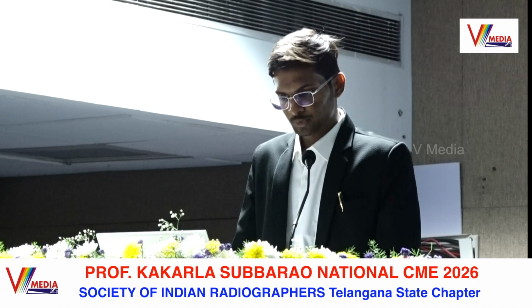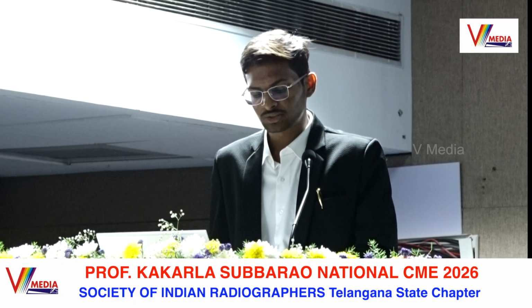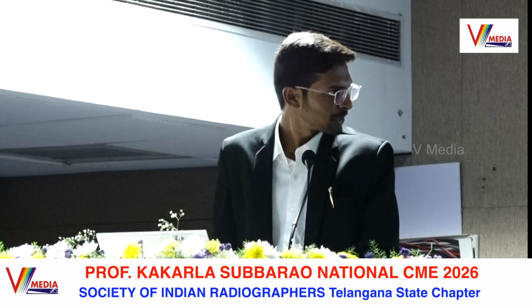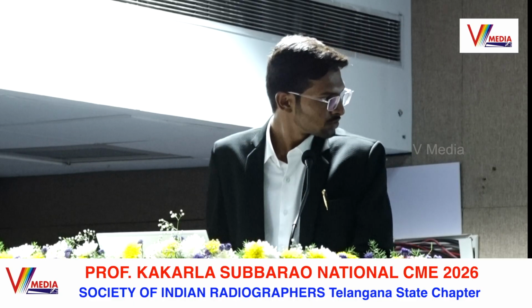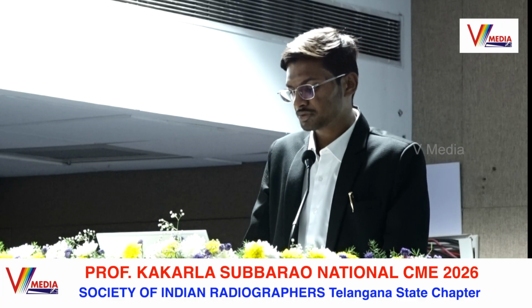And these are the post-processing techniques we use in 3 phases. First of all, multiplanar reconstruction for better visualization of arteries, veins, and lymphatics in all directions. And these are some pathologies we can see: critical limb ischemia and peripheral artery disease. The advantages are faster imaging, patient comfort, and good 3D visualization, and it is useful in acute limb ischemia.